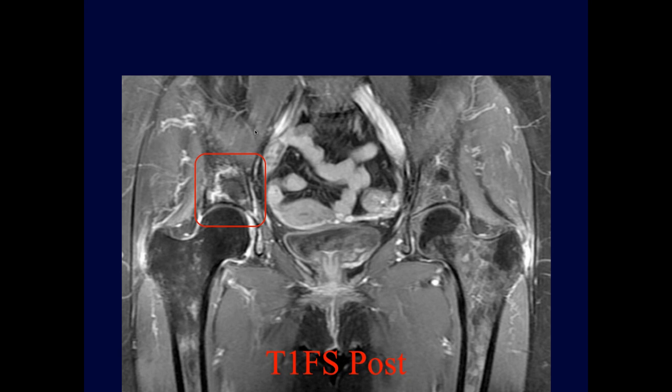And then there's also partial tearing of the gluteus medius bilaterally. So this was a patient who had lupus, and this turned out okay. Not malignant, but an infarct from lupus erythematosus. And typically with lupus, you'll see multiple infarcts.